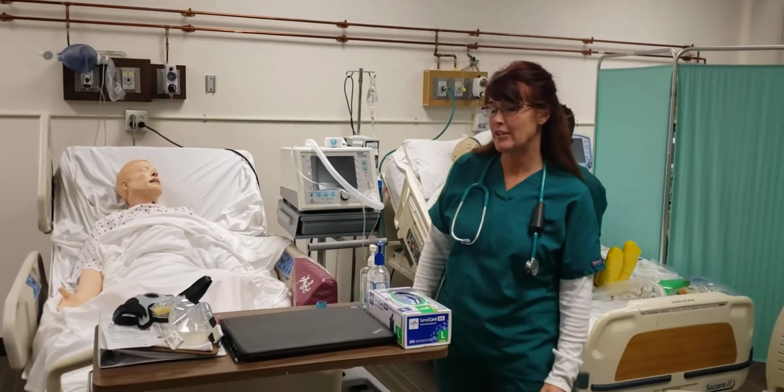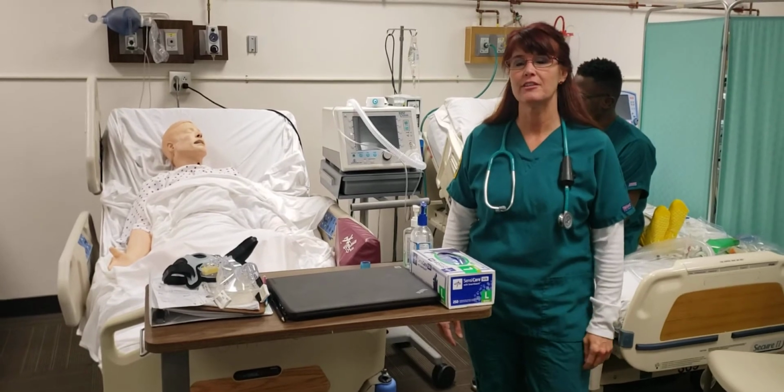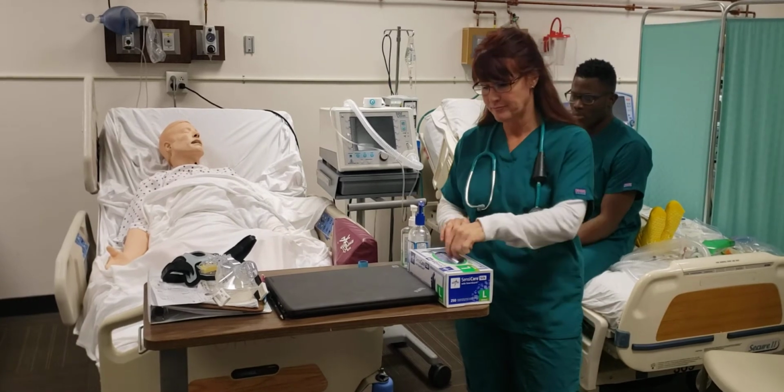Today I'm doing the video competency for initiation of NIV. So first thing you want to do is go over the patient's charts, verify the doctor's orders. You're going to perform proper hand hygiene.